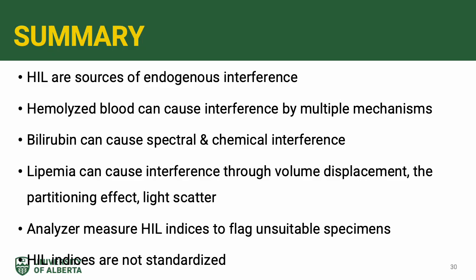Automated analyzers measure the absorbance of patient samples at multiple wavelengths to determine their suitability for analysis. These measurements are referred to as HIL indices. HIL indices are not standardized, and the CLSI recommends that labs establish their own indices and perform routine QC to monitor these indices.